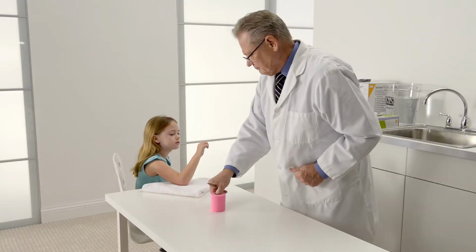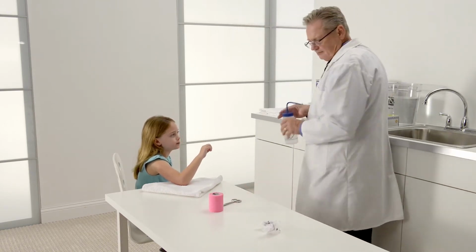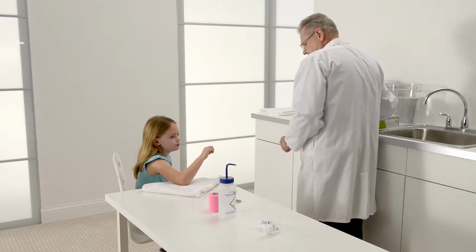Cast padding may be applied to the extremity to meet treatment goals, or if it's a fresh fracture, to accommodate anticipated swelling. Let's get started.